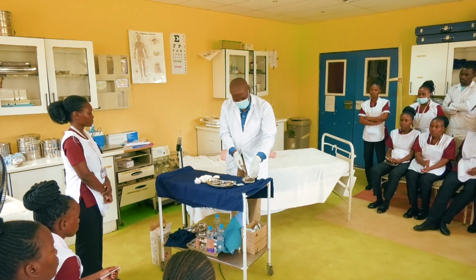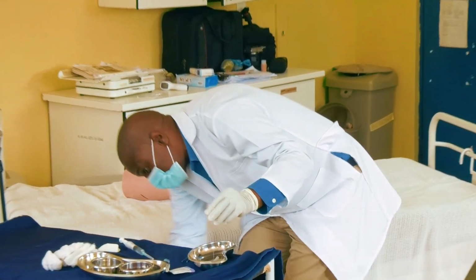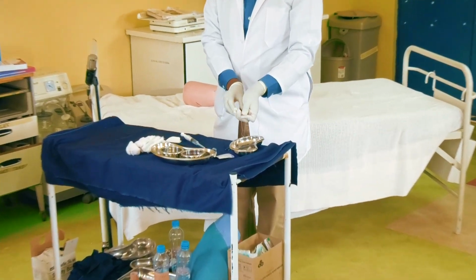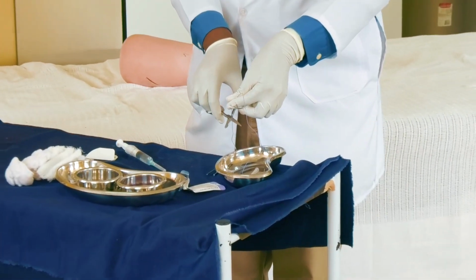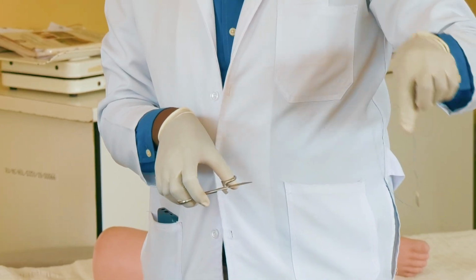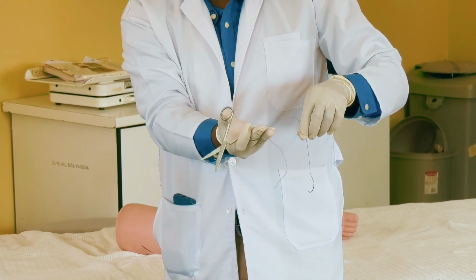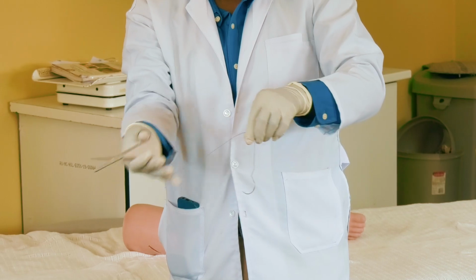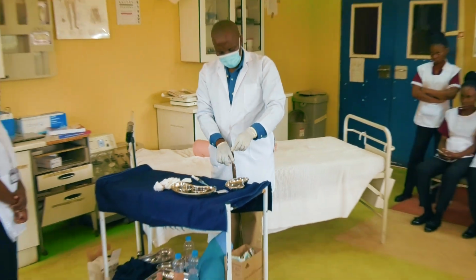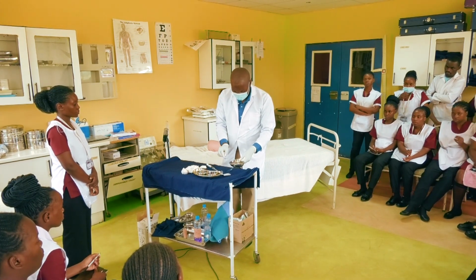All these sharps, that's why I just said the dismantling procedure follows. For the sharps, even this one is a sharp. In fact, what you're supposed to do here, where's the scissors? Let me just show you, since we have got this sharp. Remember the sharps container was mentioned somewhere. Cut this short, because if you just throw it like this, this is the sharp. Someone will come and get hooked in here, then the needle will follow it. So cut it short so as to ensure that whatever you are throwing in there goes into the sharps container.